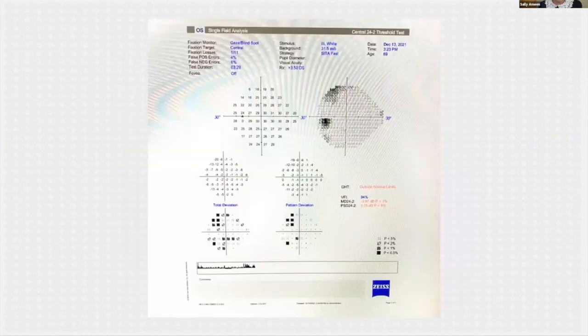But that's reassuring, because when it comes to management of these patients and planning for surgical intervention, when you look at this and, you know, we're getting closer and closer to Christmas and the patient's really asking you to try and hold off as much as possible, you can probably breathe a slight sigh of relief and think, okay, time's on our hands, we can wait a little bit, and then address this very soon.